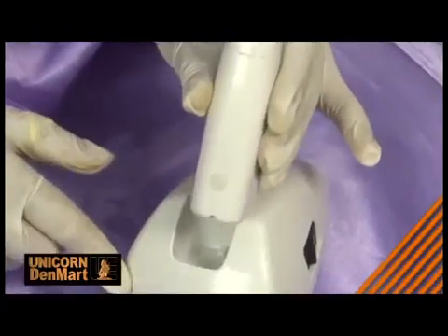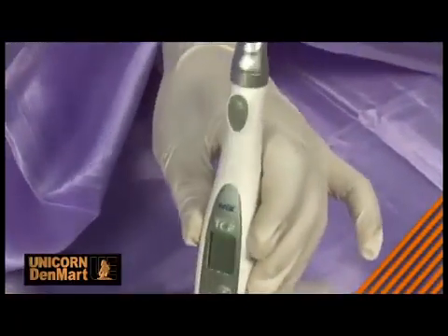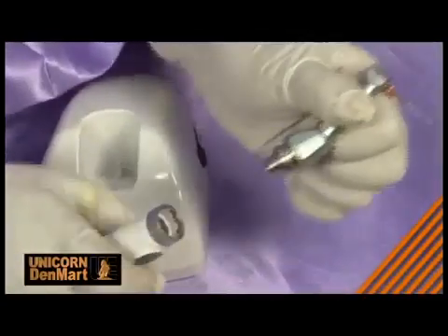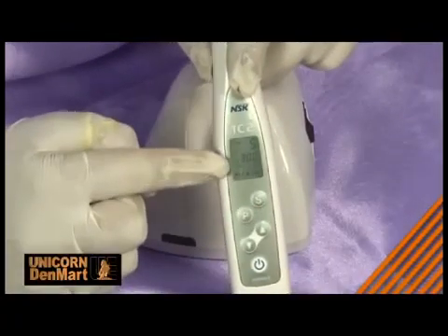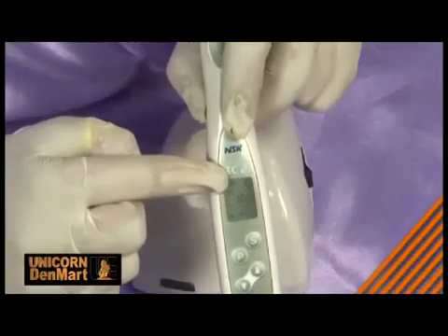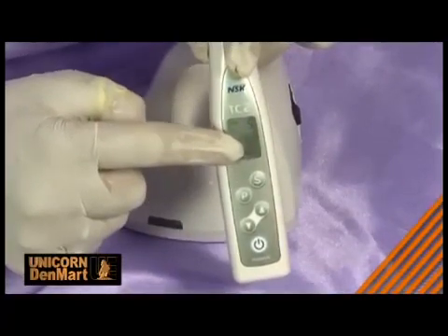it accompanies the user even during long hours of treatments. This comfortable handpiece allows the miniature head to adjust to 6 different positions. With 9 preset memory programs for speed control, this micromotor can be widely used for a wide range of treatments including endodontics and prophylaxis.